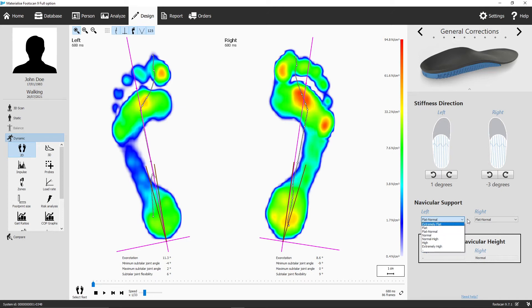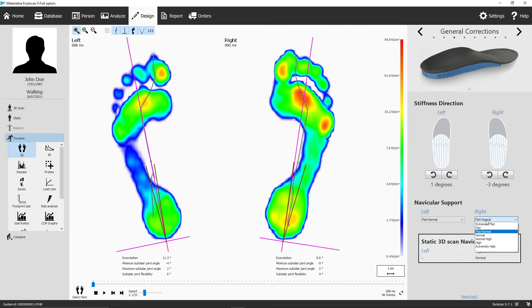If you also have a 3D scan of your patient's feet, you can see the statically measured navicular height. This extra information helps you to verify the suggested navicular support of your insoles.